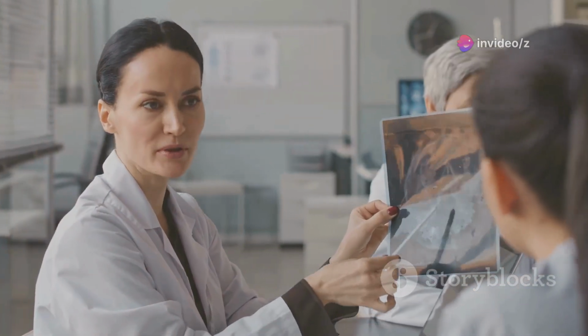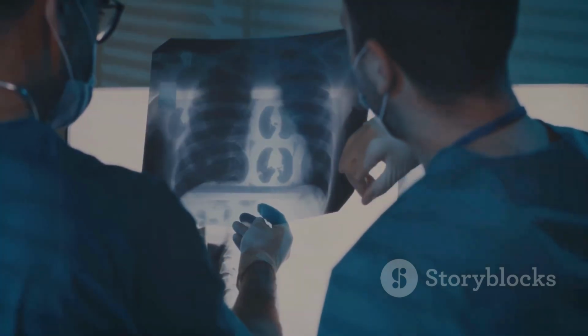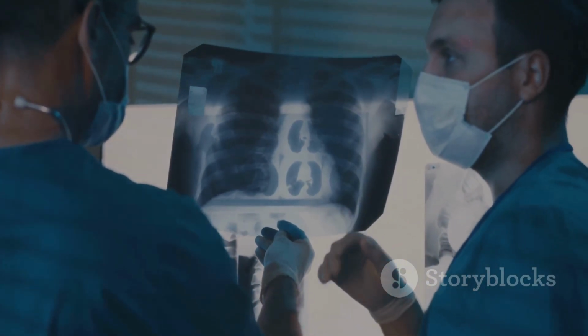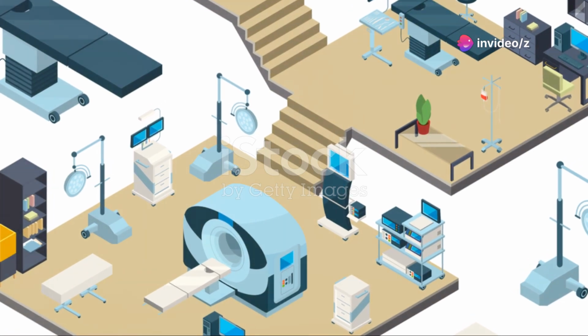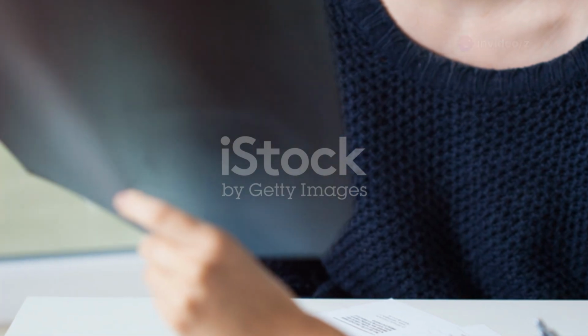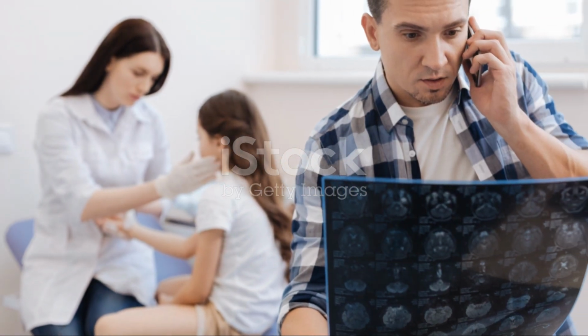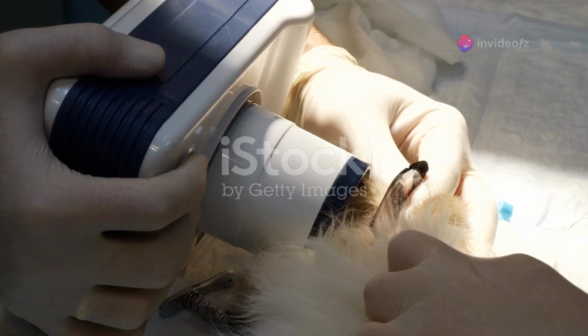It allows healthcare providers to visualize the bones and joints, identify any damage, and determine the most appropriate course of treatment. From the emergency room to the orthopedic clinic, MSK X-rays are an indispensable tool for diagnosing a wide range of conditions. They are quick, painless, and relatively inexpensive, making them a readily accessible imaging modality.